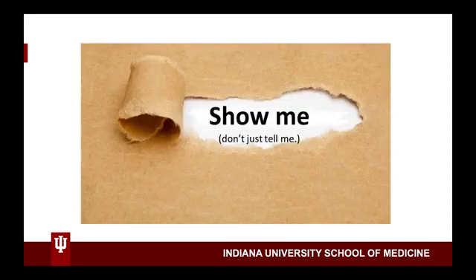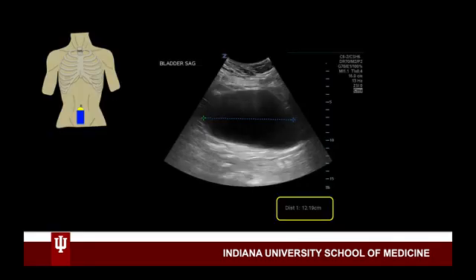Let's see a couple of examples. First, place the probe in the sagittal view and find the greatest length of the bladder. Freeze the image and measure the length. In this image, the length is 12.19 centimeters. When we calculate our bladder volume, we will round this to the nearest centimeter. So in this patient, you would write down 12 centimeters for length.